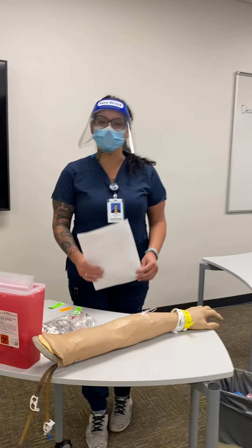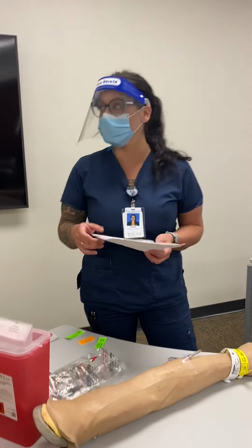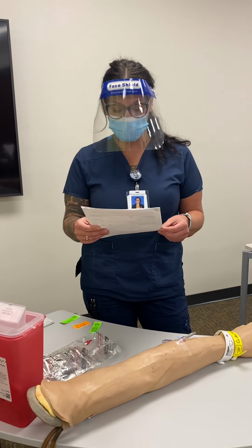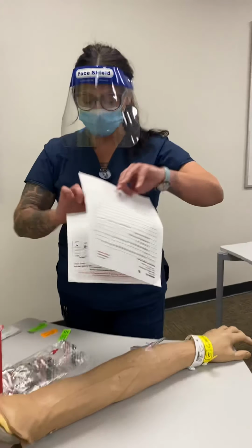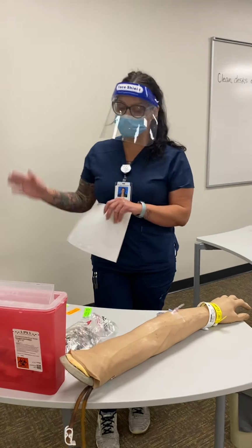Hello, my name is Sarah New, and today I'm going to be demonstrating how to do an IV bolus of medication, as well as how to hang a secondary small bag of medicine. Just showing the camera that there's nothing on my paperwork. Okay, so I've entered the med room. I have washed my hands.